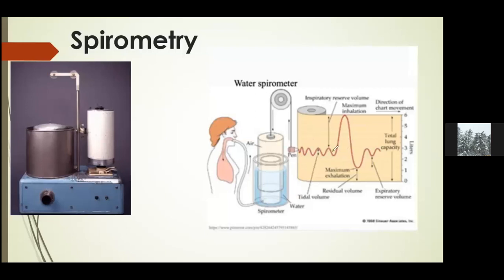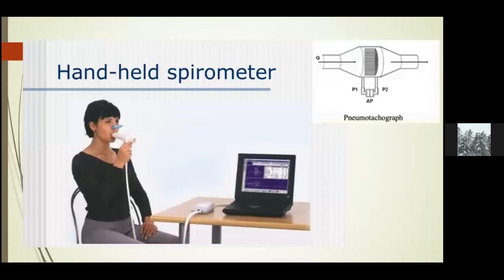Once you're able to relate that, I will take you to the modern spirometers, which instead of using this movement of a bell up and down, use something called a pneumotachometer. Now, what this does, it is a handheld device. You can see this lady holding it here.